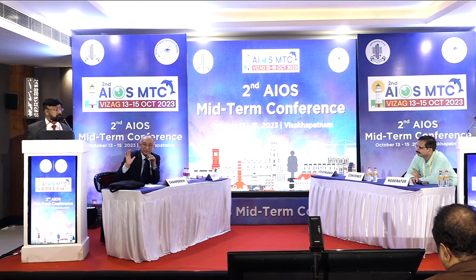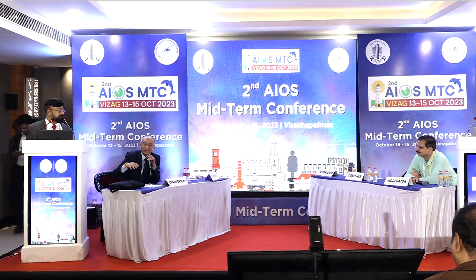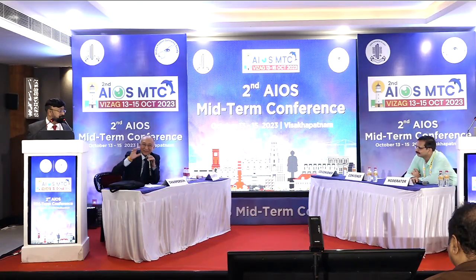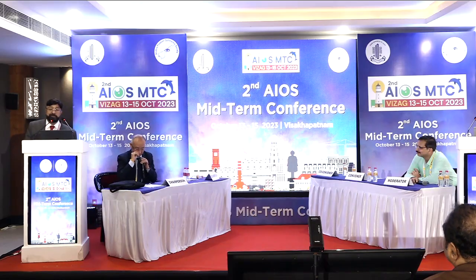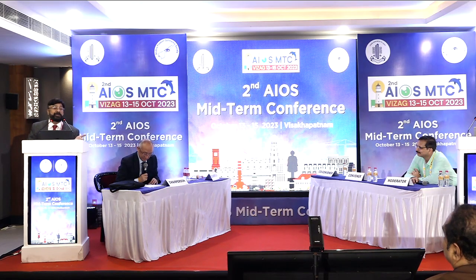So we have seen so many videos. CTR is a must sometimes in your operating area, not on the table. It should be in your operating area. Suppose you have something, you can easily put in a CTR and manage the bag. Thank you, Dr. Kashyap. I had to check 3-4 years of my surgeries, and I could find so many CTR.